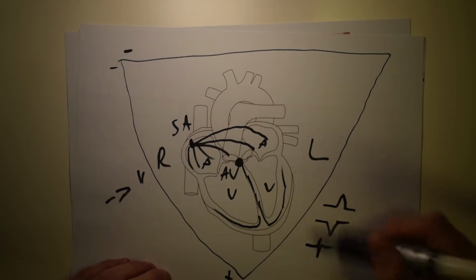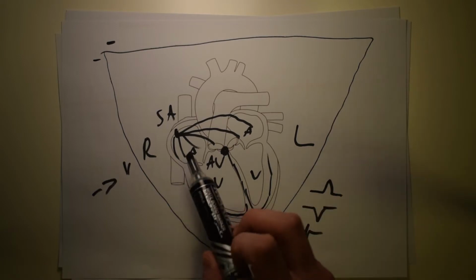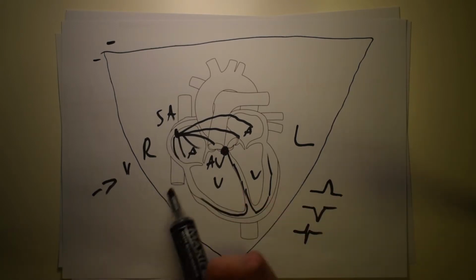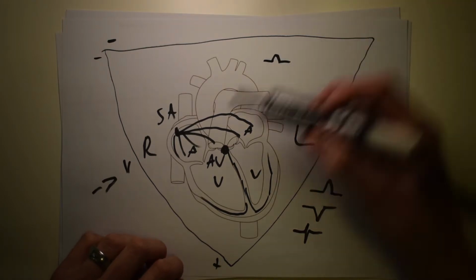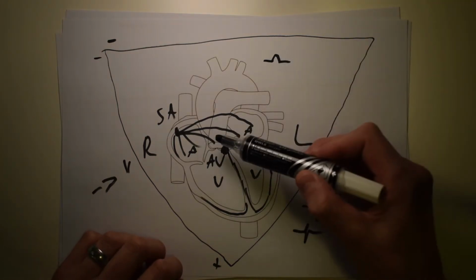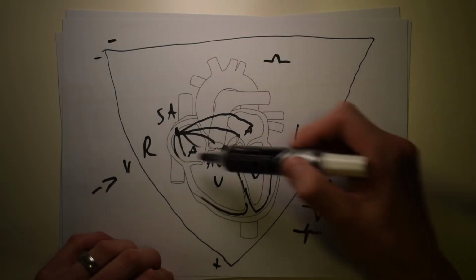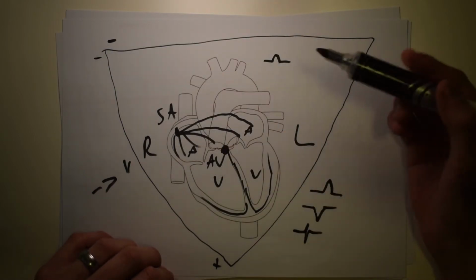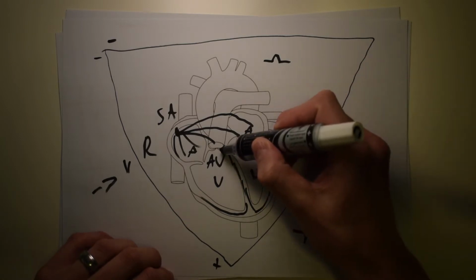When we are looking at an ECG, we first see the SA node fire, and we see a P wave. You notice how it's not very big, and you notice how it's positive. That's because it's going from negative to positive, and there's a movement of conduction, so we see a small positive wave. Then there's a little pause in the AV node, which has some other name, but for now not so important.